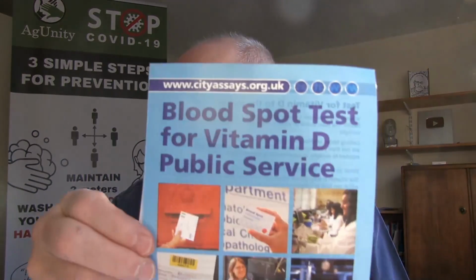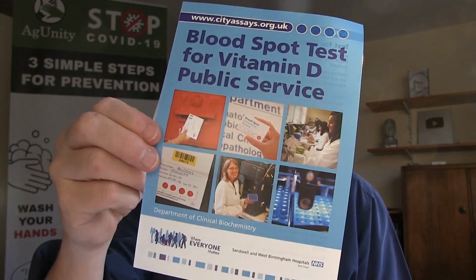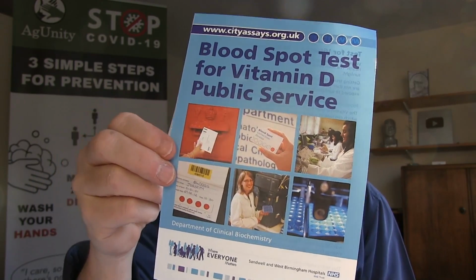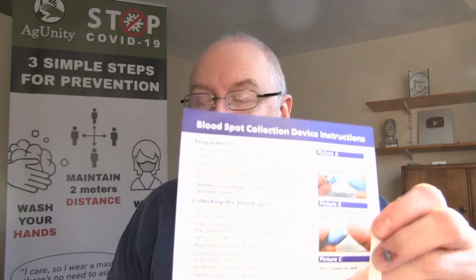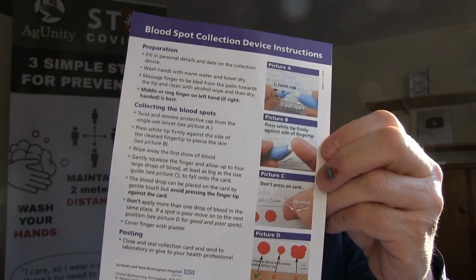Yeah, surprisingly low. Now we're going to try this vitamin D test here, a blood spot test for vitamin D, a public service. And this is an NHS facility. It gives you all the instructions you need to follow there. Hope I don't mess it up. Pricking your finger, putting the blood on. And it gives you some more detailed instructions in this booklet. So without further ado, let's go for it.